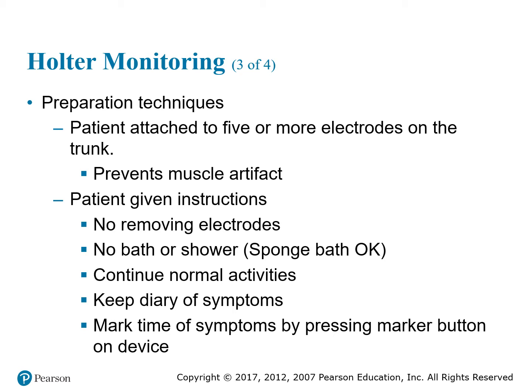So we also have to, especially with kids, when children experience Holter monitoring, it's sometimes a scary thing for kids. So we just have to make sure we talk down to their level. We don't use too many big terms, and we try to make it fun and exciting for them so they won't get scared.